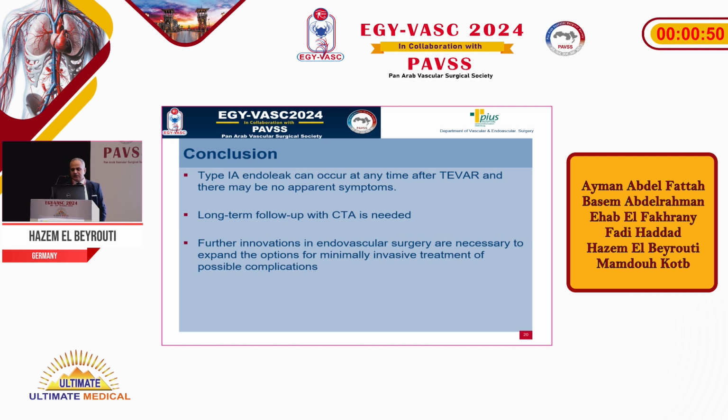As a conclusion, after TEVAR, long-term CTA follow-up is required, as type 1A endoleak can occur at any time, and further advancements in endovascular surgery are needed to expand the possibility to treat such complicated cases.